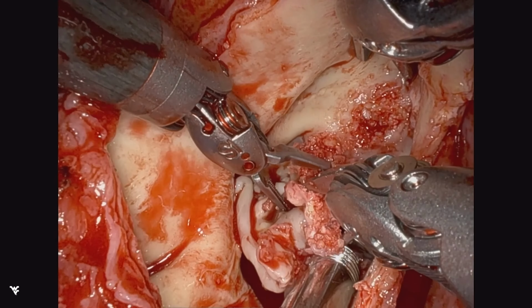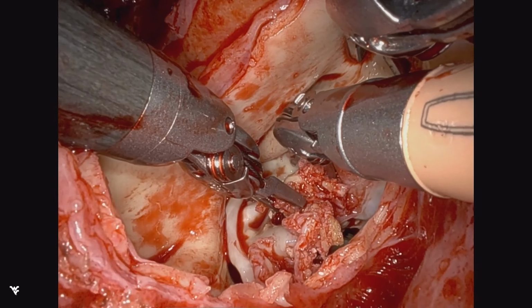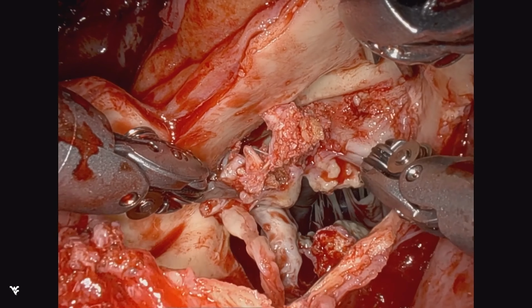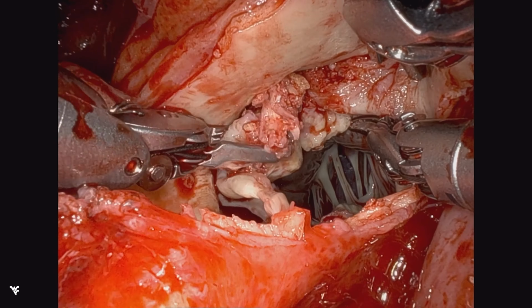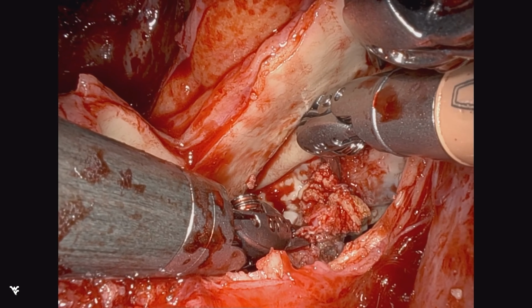The important thing is to never leave calcium behind in a major way, but also be safe within your ability, your institution, so that we are not doing a full root replacement. You can see the penetrating calcium in the left ventricular outflow tract here.